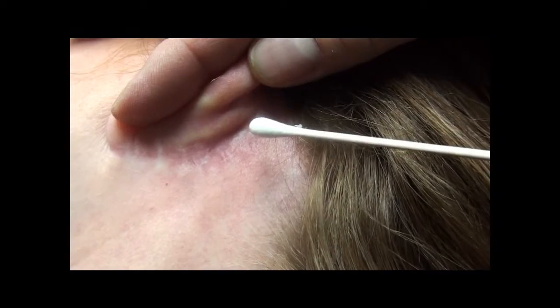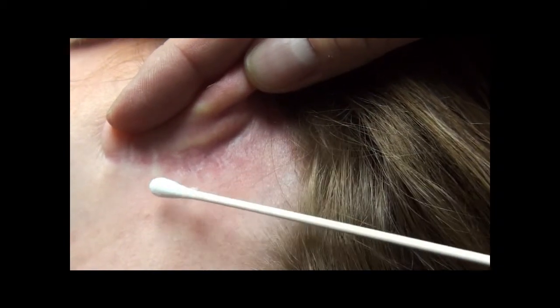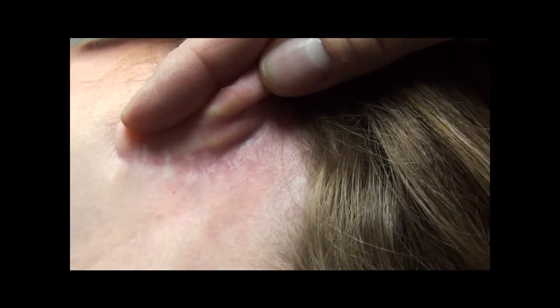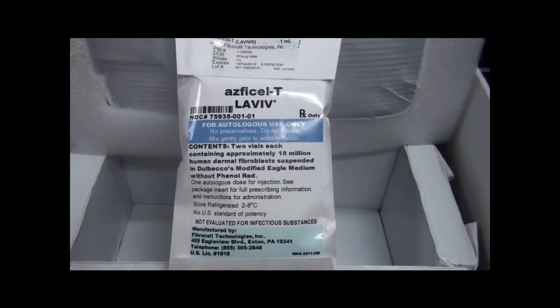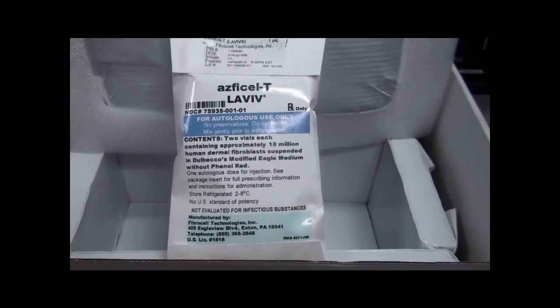Today we're injecting Julie's nasolabial fold wrinkles. Ninety days ago we took her three millimeter biopsies from her left posterior region. You can see these have healed up beautifully. This morning we received her tissue cultured fibroblasts via FedEx. We've confirmed the patient's identification of her cells.